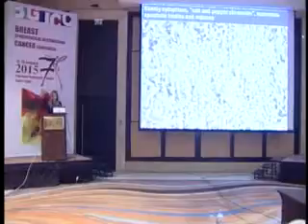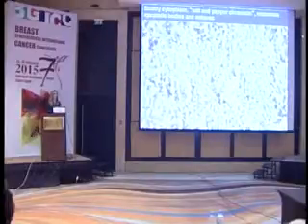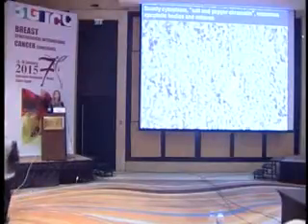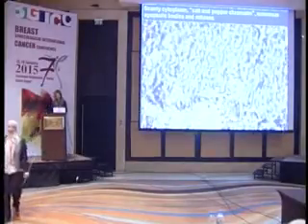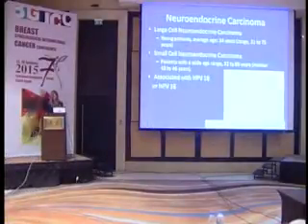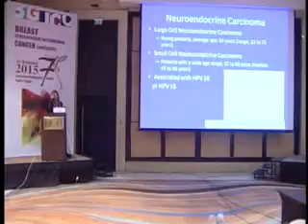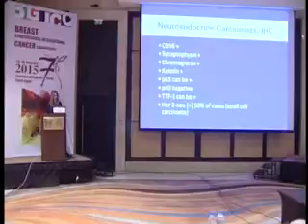So, salt and pepper chromatin, there is no nucleoli. Look at that. In the small cell, you do not see the nucleoli. You might see it in the large neuroendocrine. Okay, what else? Numerous apoptosis and mitosis. And it is HPV 18 and 16. If it is large cell or small cell, both do badly. Okay? And these are the different markers that we use.